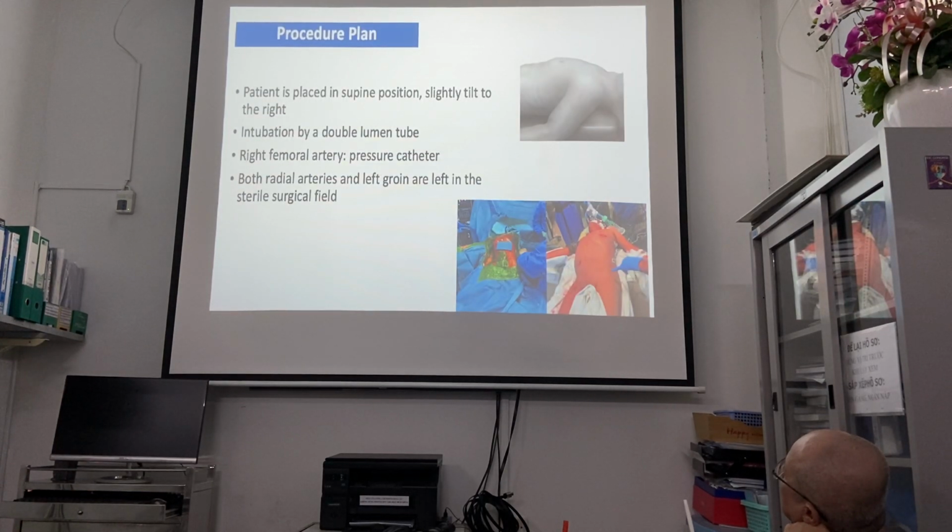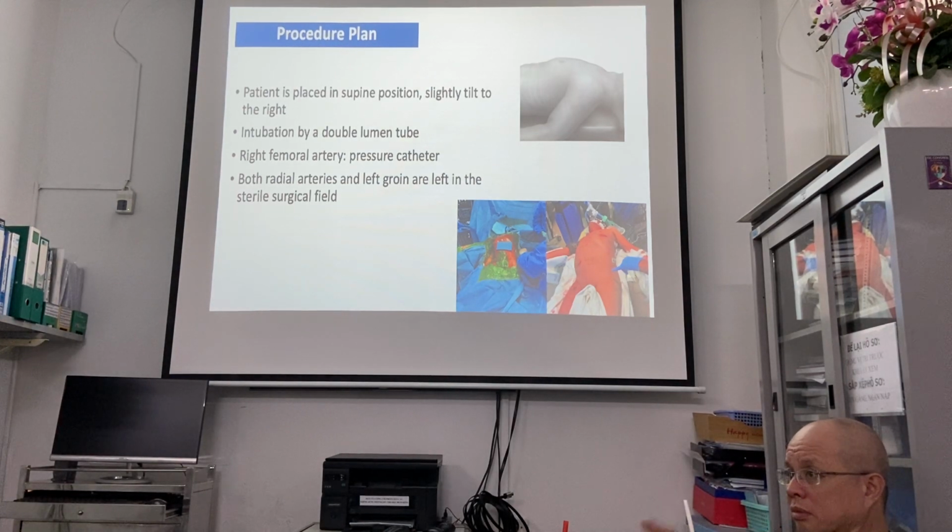So this is the patient on the table, and the surgeon will make a small cut down. You see, what is the problem? What can happen? What should we do? What can be the complication if you try to aspirate this thrombus? Yes, it can embolize, and where can it embolize? What we said before, in the brain.